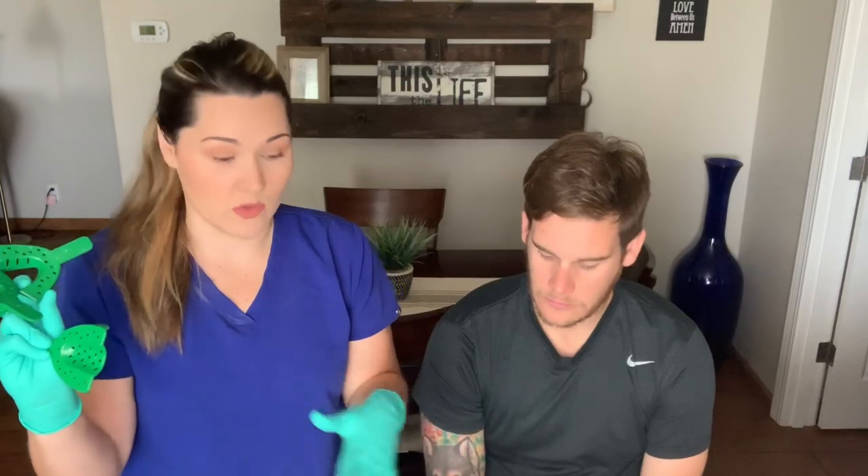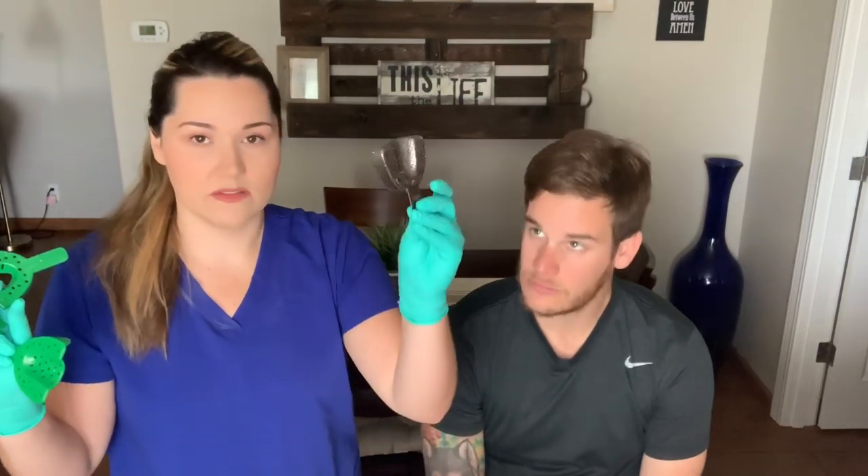We're going to be using the large ones. If you've tried in trays in the patient's mouth, I always throw away the plastic ones. The metal ones you can of course sterilize.